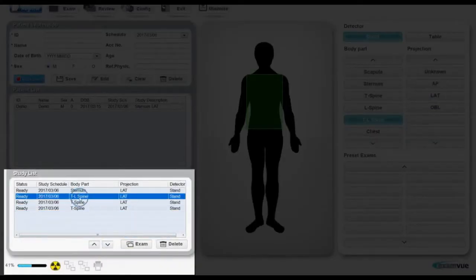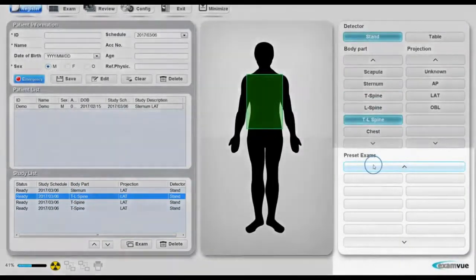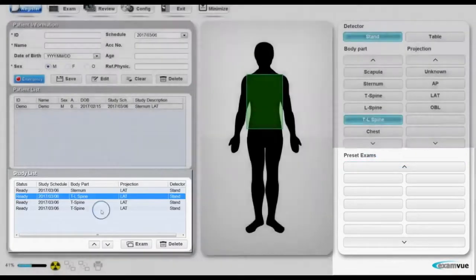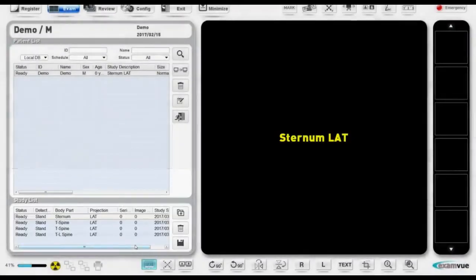You can also set preset exams, which will be a list of several x-rays you take together regularly, such as spinal exams or accident exams. Once everything is set, click the exam button.